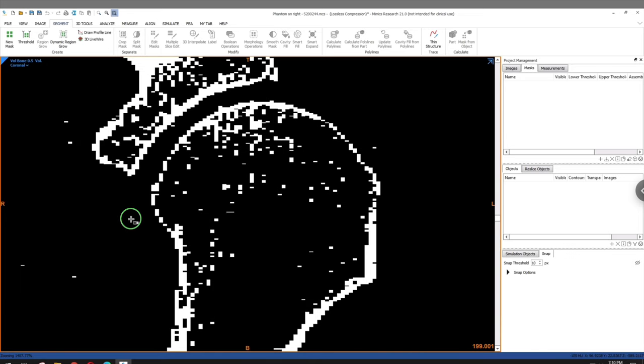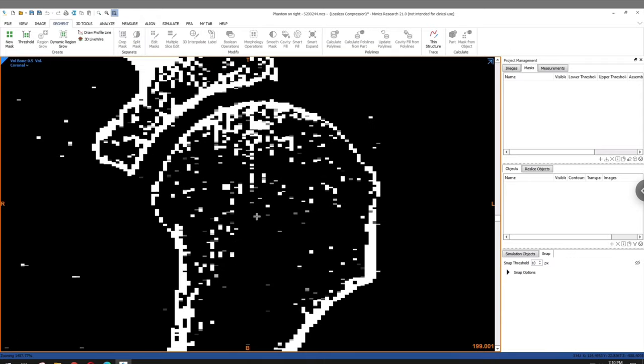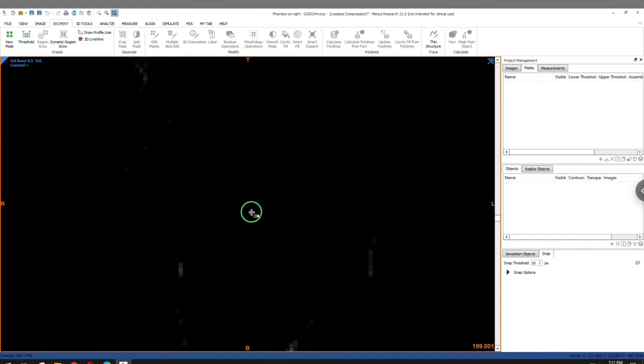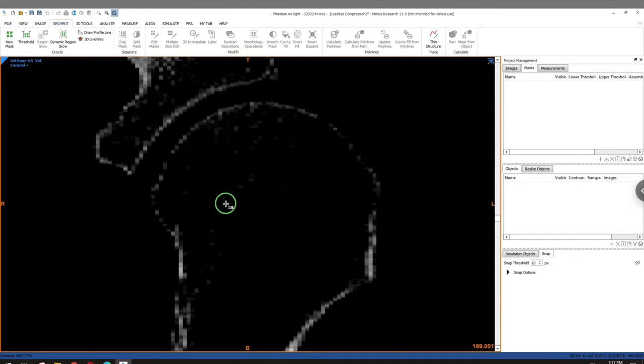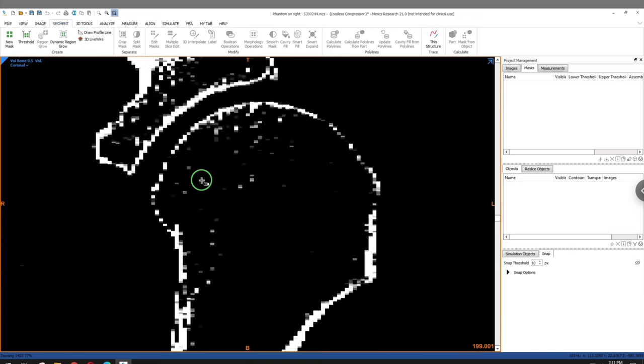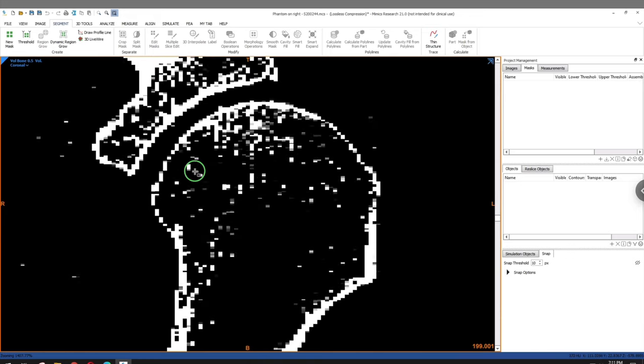So now, as you can see, what I'm doing here is I'm just playing around with contrast settings to isolate what I consider to be a cortical shell of my humerus. This doesn't affect the CT data whatsoever. It's just a visual representation within Mimics itself, and it's just going to help me personally to isolate that cortical shell so I can segment it in the next step.